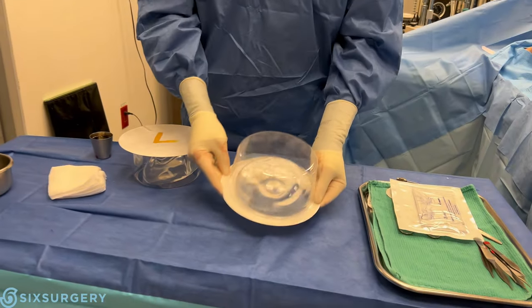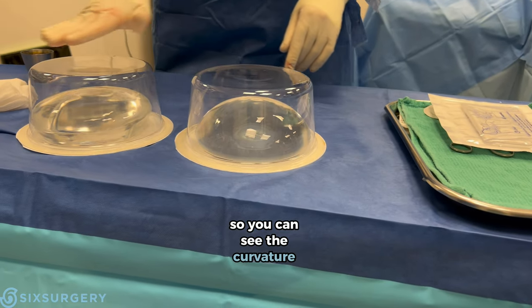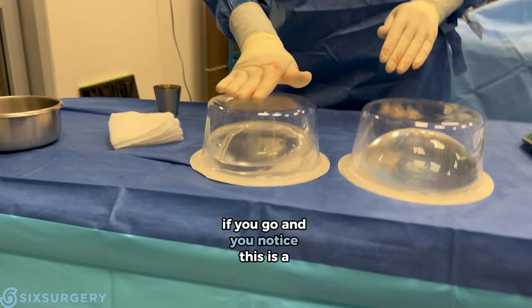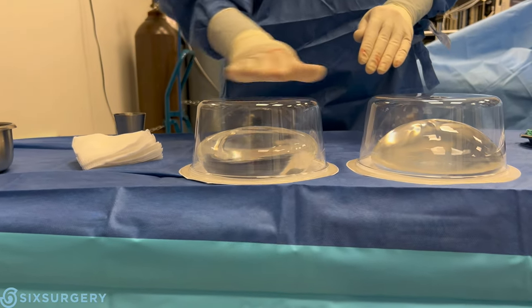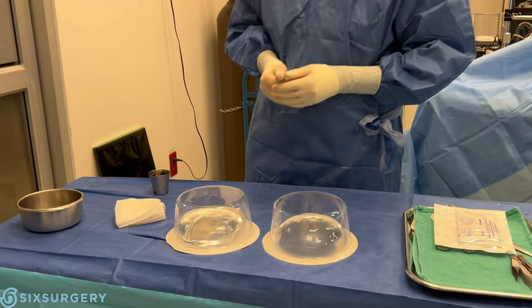This one is upside down and this is right side up, so you can see the curvature. This is the back of it — if you notice, this is a little bit flatter, that's the back of the implant. This is the front of the implant — it's a little round. Can you see the difference? Excellent, okay.